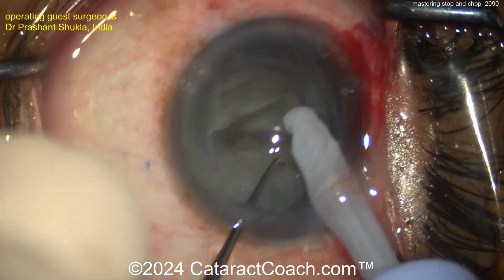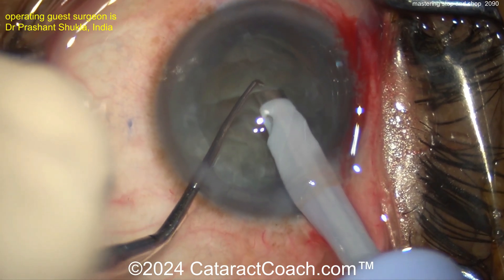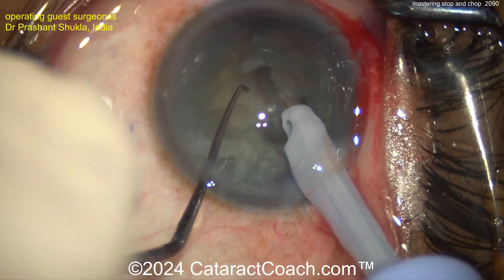Now, switch over your settings on the Phaco machine to a chop setting — higher vacuum now, maybe a little higher flow. Buzz into the piece, and then you can get a hold of it and then chop it.